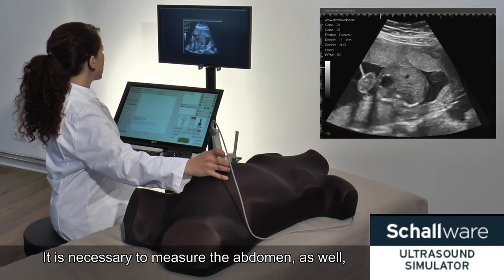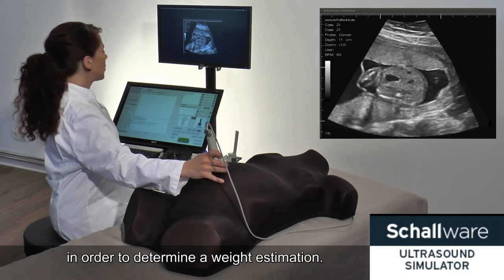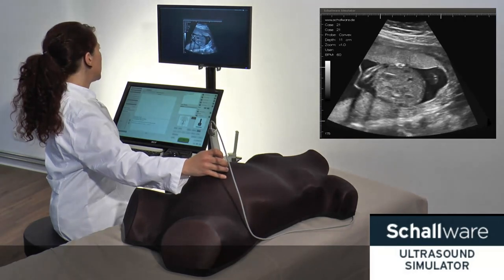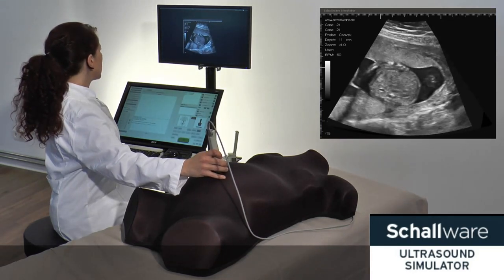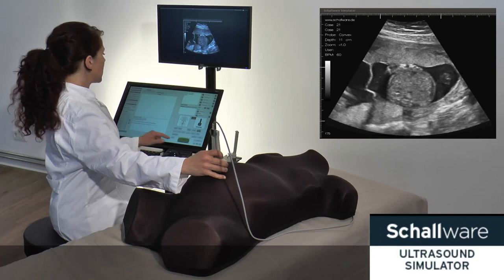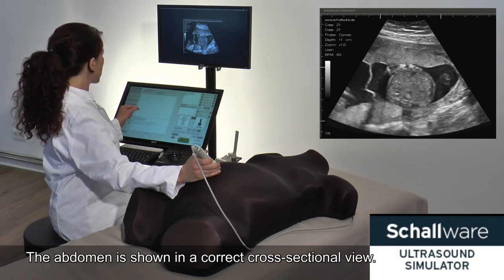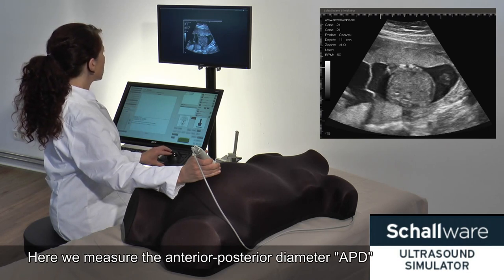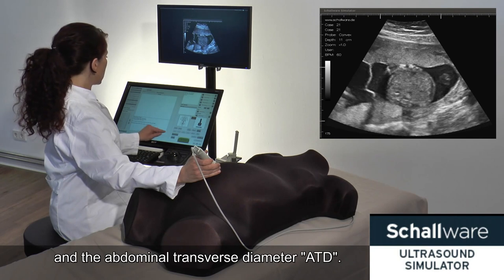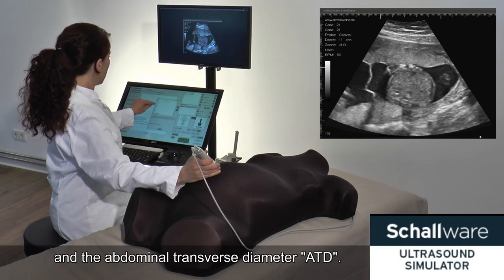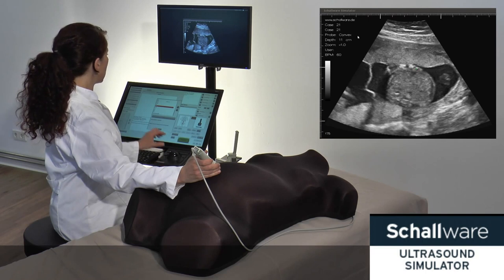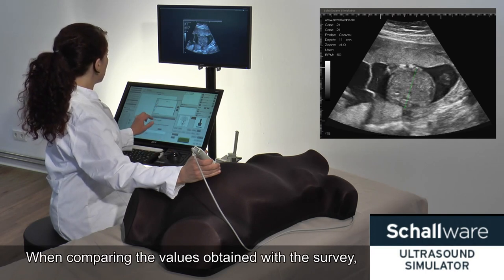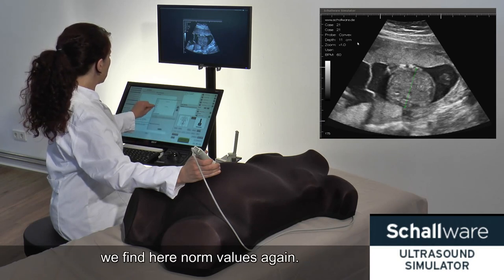It is necessary to measure the abdomen as well, in order to determine a weight estimation. The abdomen is shown in a correct cross-sectional view. Here we measure the anterior-posterior diameter, APD, and the abdominal transverse diameter, ATD. When comparing the values obtained with the survey, we find norm values again.